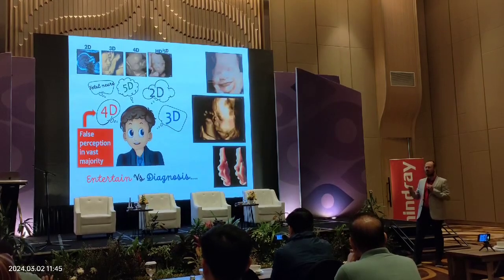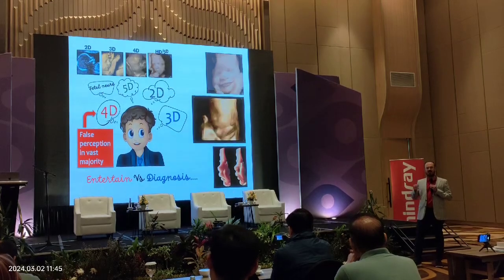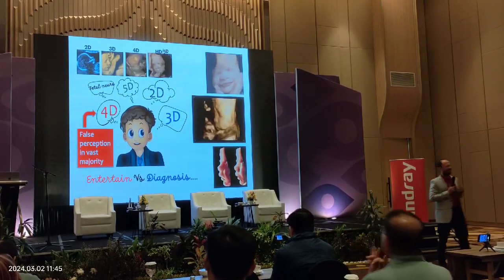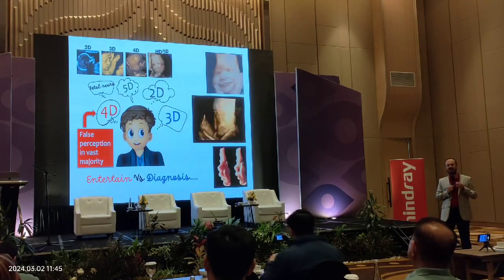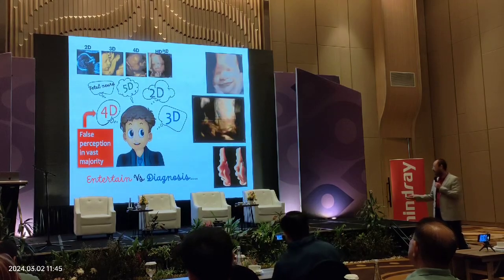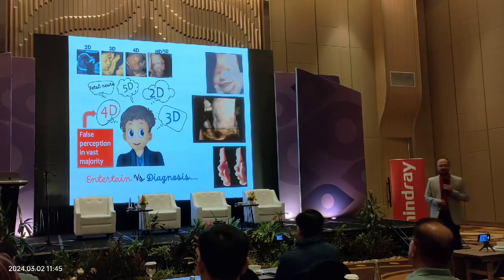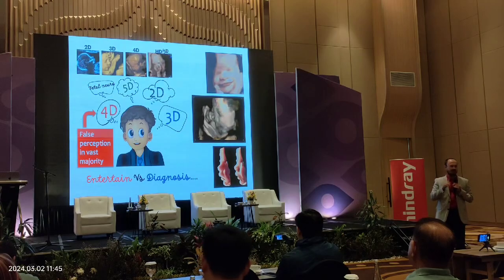"Doctor, I want to do 4D to determine whether my fetus is alright or not." That is unrelated to what we do for diagnosis. Entertainment and diagnosis are quite different terms that we have to anticipate.